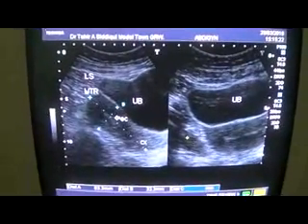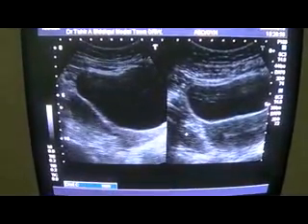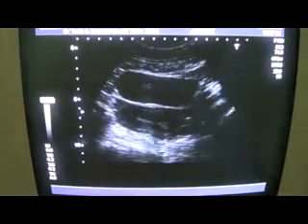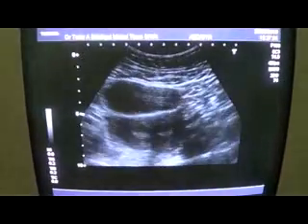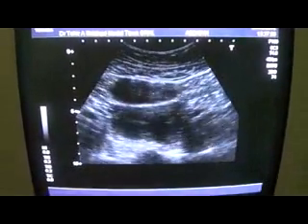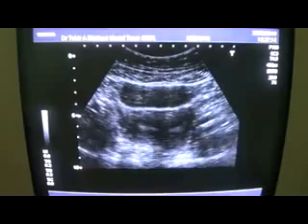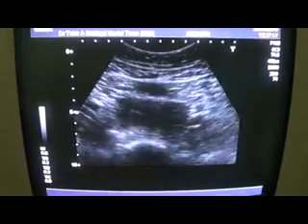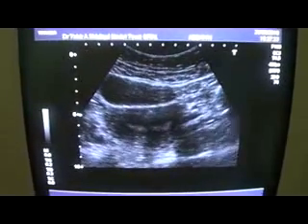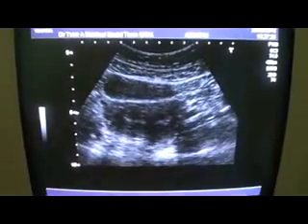So now let me show you all this in real time. First I will get the uterus in transverse section. This is the transverse section, and in this transverse section you can see that there are two canals, two endometrial cavities. Yeah, here.